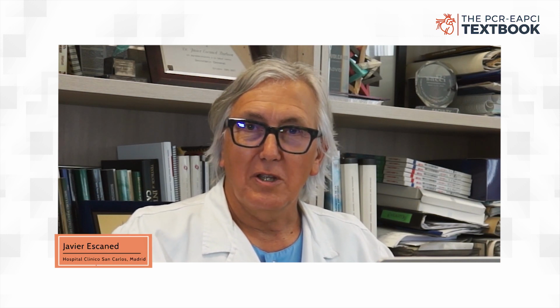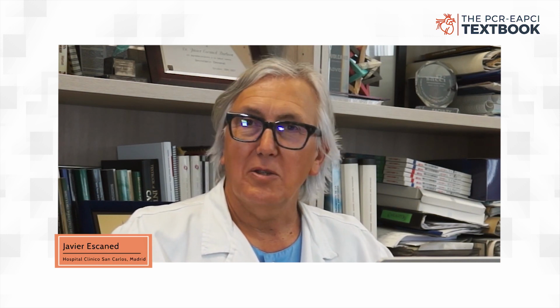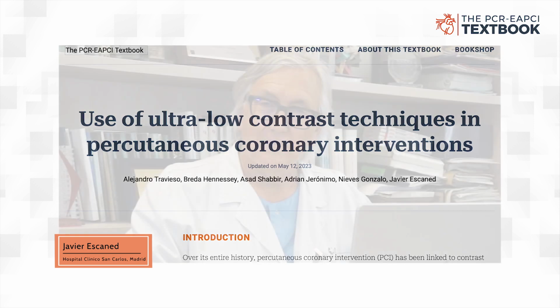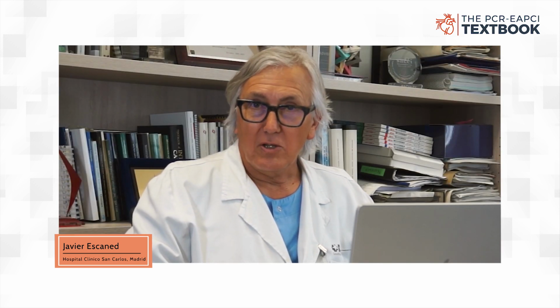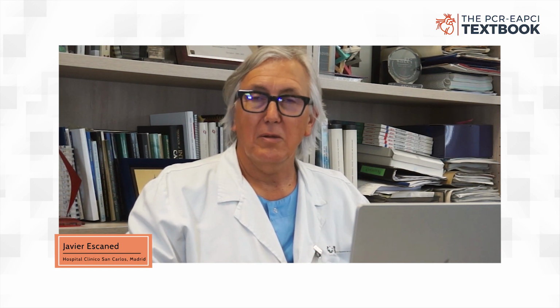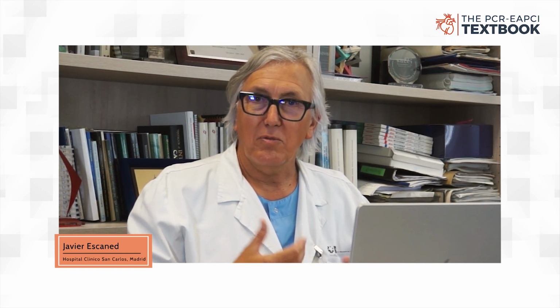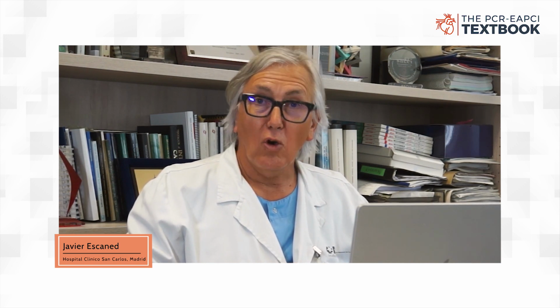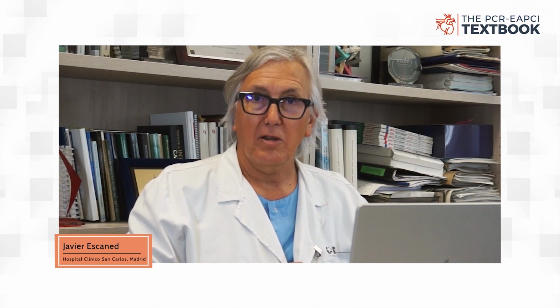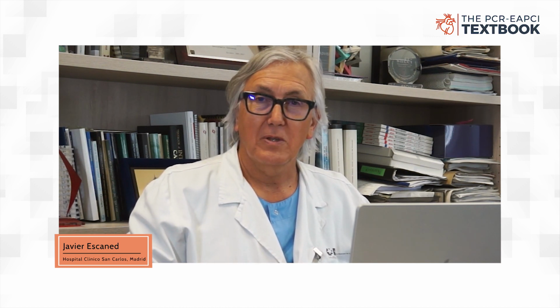Hello, it's a pleasure to introduce a new chapter in the PCR EAPCI textbook. It is entitled Use of Ultra-Low Contrast Techniques in Percutaneous Coronary Interventions. As interventionalists, we've been trained in performing interventions or performing a PCI in vessels that have to be opacified with contrast. This is rooted, of course, in the only way that was available at the time of Andreas Grüntzig to visualize the coronary vessels, the coronary angiogram.